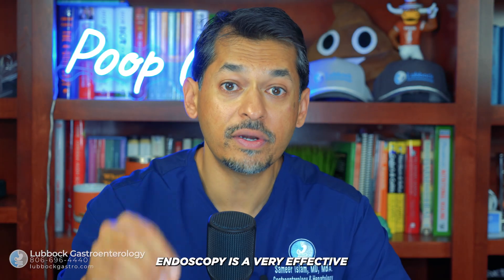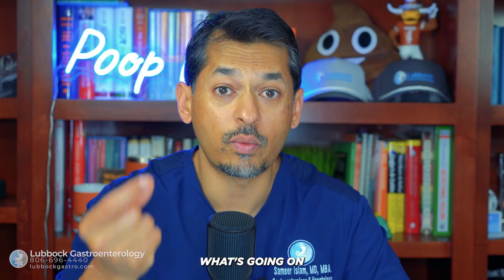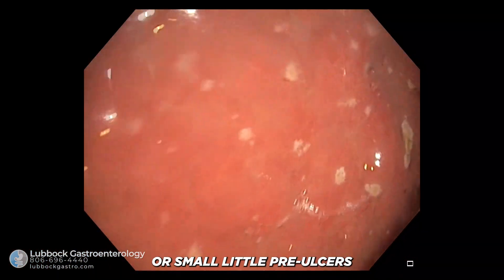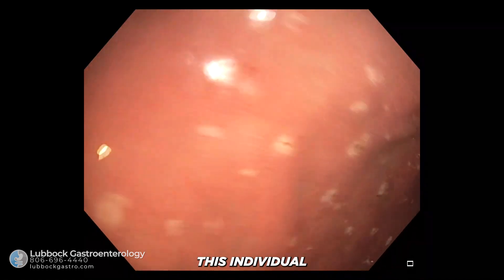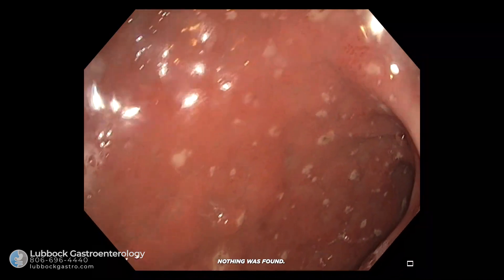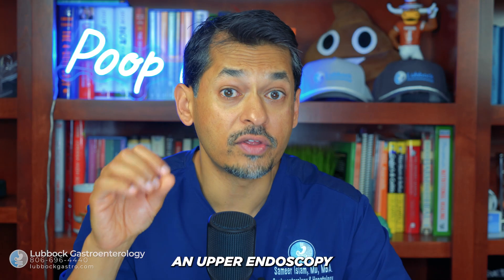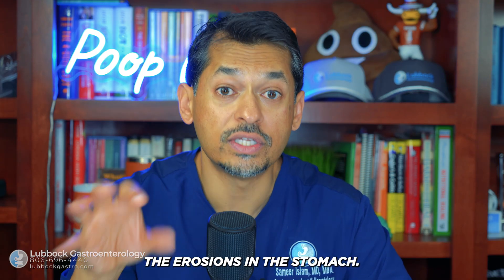What we try to do is find out exactly what's going on. An upper endoscopy is a very effective option that allows us to see exactly what's going on. On this upper endoscopy, you can see what are called erosions or small little pre-ulcers in the stomach. This individual was complaining of nausea and vomiting for quite some time. They did an ultrasound and nothing was found — everything came back normal. So because of that, we ended up doing an upper endoscopy or EGD, and here you can see the erosions in the stomach.